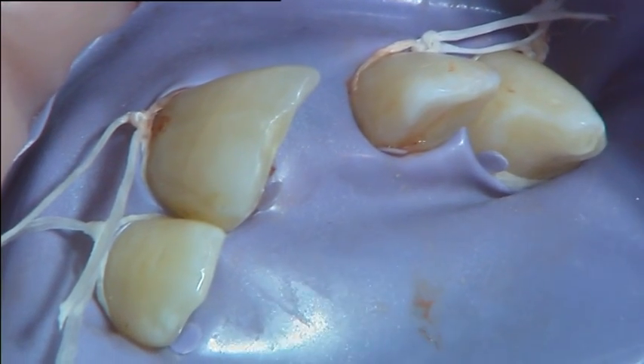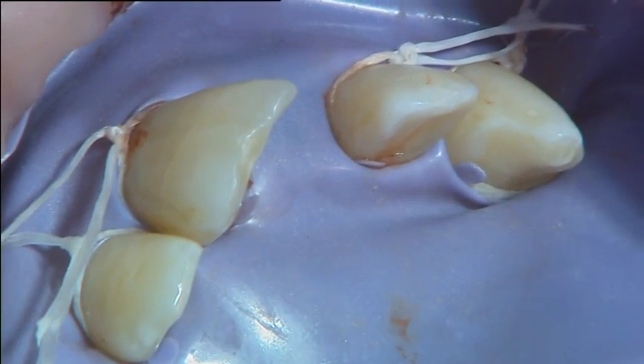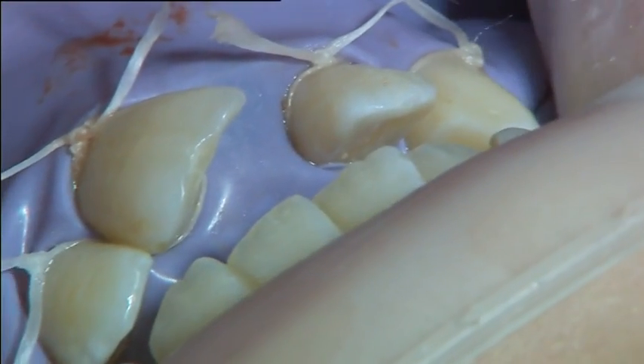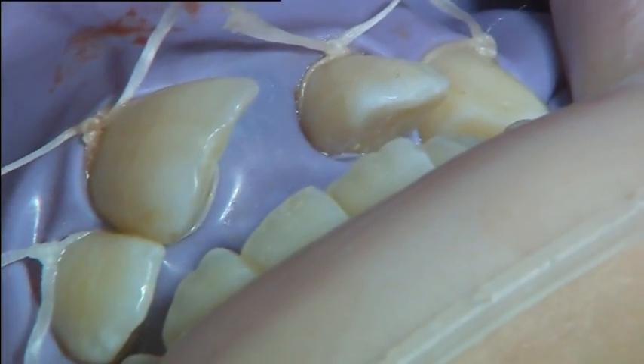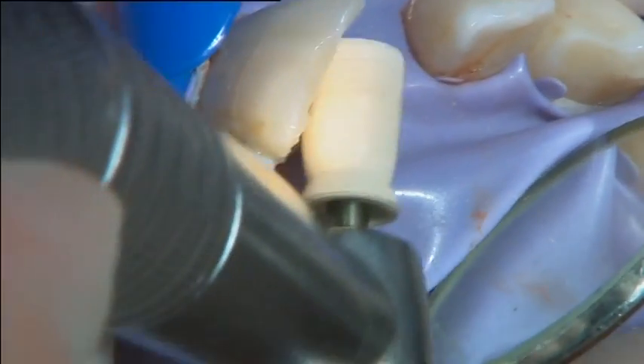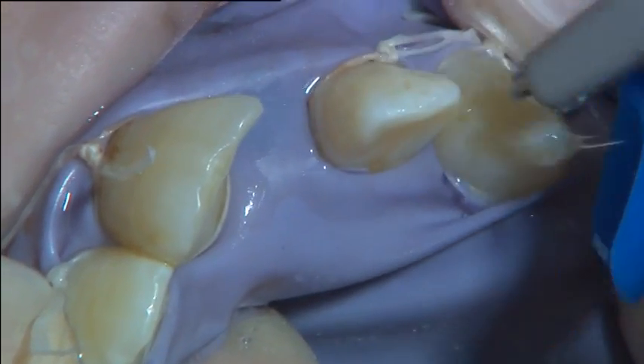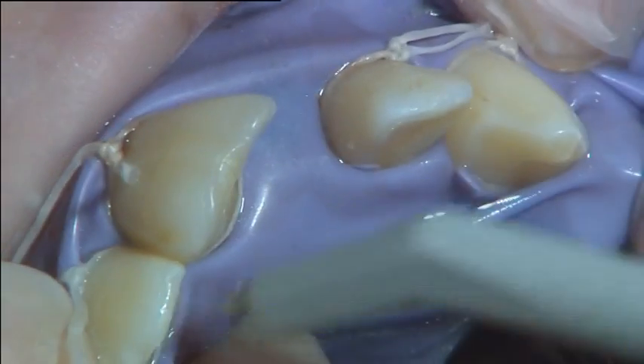The rubber dam was placed in order to keep the working area dry. The area to be bonded on the teeth was first cleaned with pumice and water, rinsed with water and then air dried.